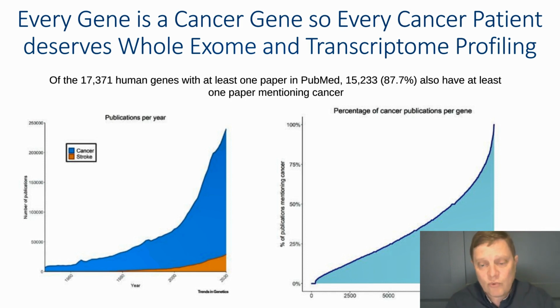And so, we've focused all our efforts on a relatively small number of genes because they've given us the biggest impact, but also because of the technological limitations. It wasn't really feasible to run whole exome and whole transcriptome on every single cancer patient, but it is now. The technology is available to us, and we can do this in routine clinical testing to be able to gather this information and really start to expand our understanding of patients' disease and how best to make it better for them, to find new opportunities to treat them, to find new drug targets and develop new improved therapies.